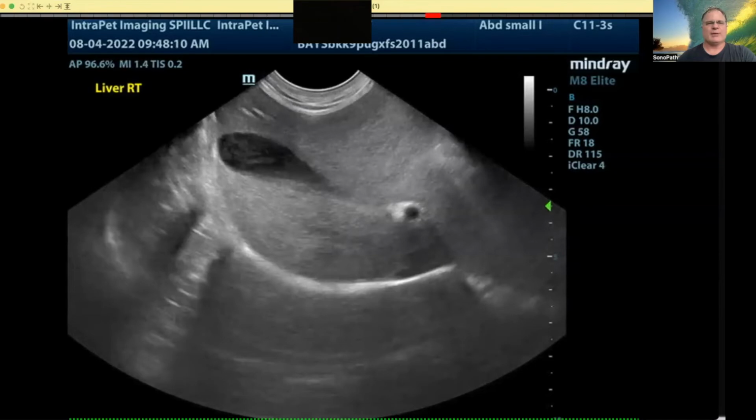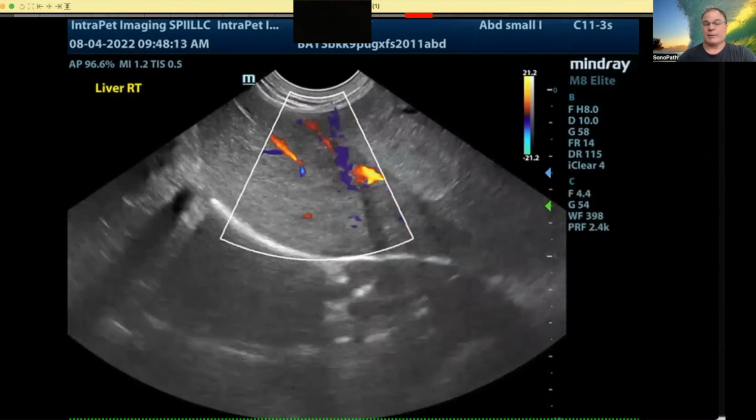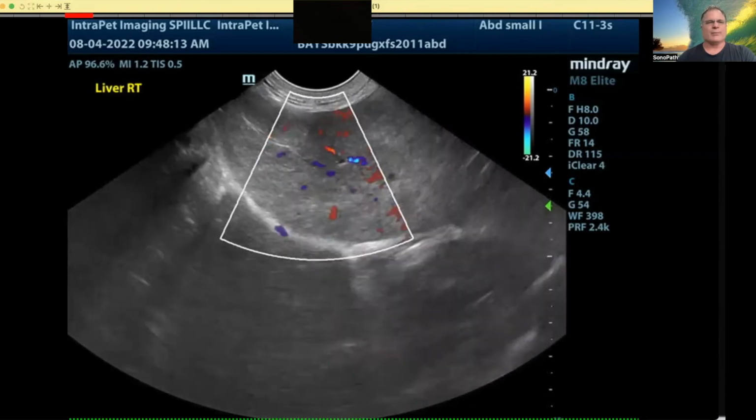And this is why I came up with the curvilinear theory to sonographic pathology, which, plug, we are going to have a download of the curvilinear theory, explaining how it works and how you interpret everything.